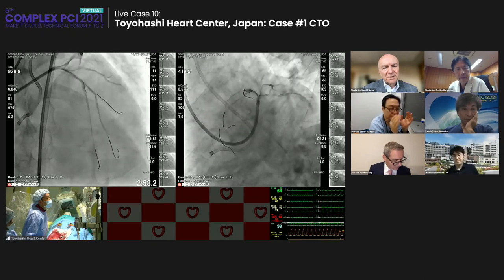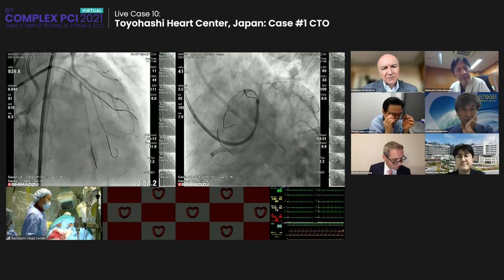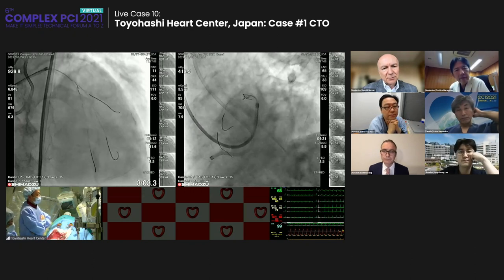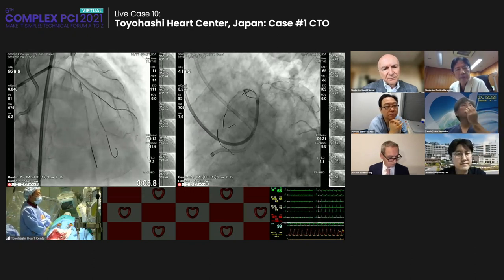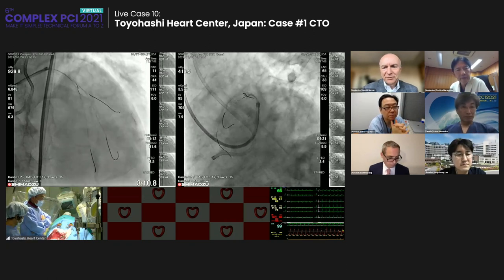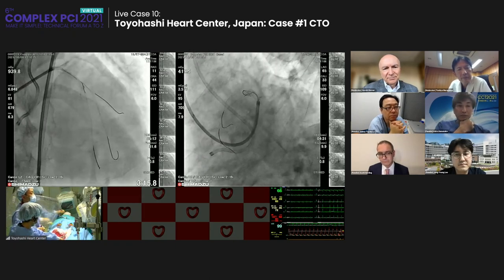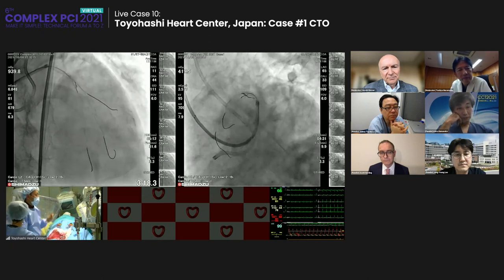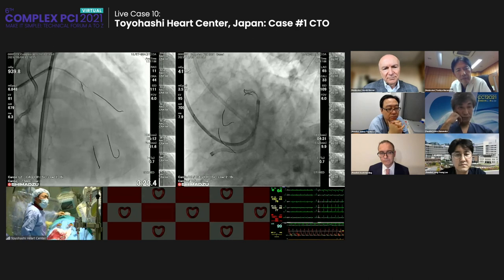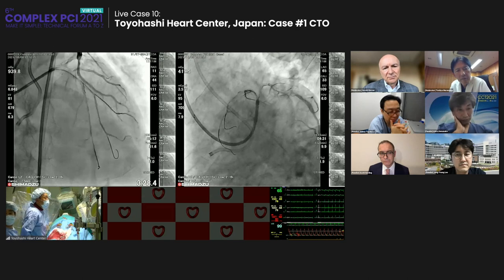Do you want to use the same stent to also cover the LAD diagonal? I think that could be done by using a well expandable stent, to avoid too much material. But maybe we should select only the 2.5 stent for the distal diagonal to the LAD. Maybe I want to simplify the procedure so that I still selected the mini crush.